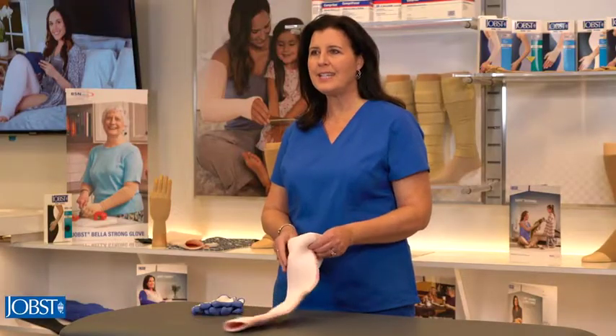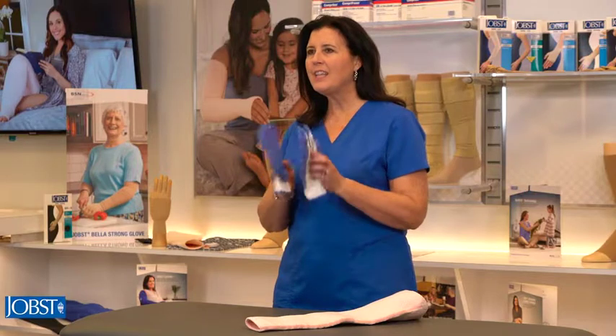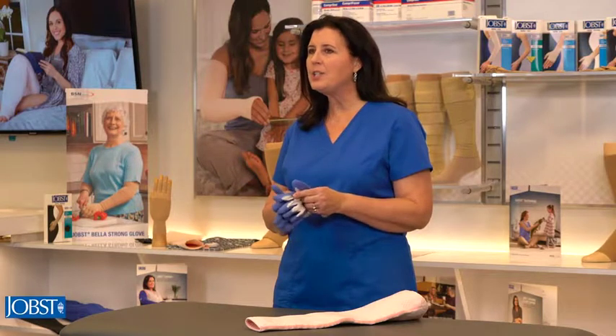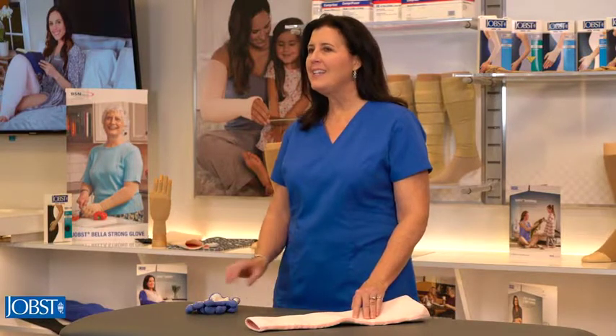To make the donning process easier you'll need a pair of donning gloves. The donning gloves have a tacky surface in the palms of the hands that grip the fabric, allowing you to adjust the garments on the body without having to pull a seam or along the top. These gloves can be used to don any JOBST stocking.